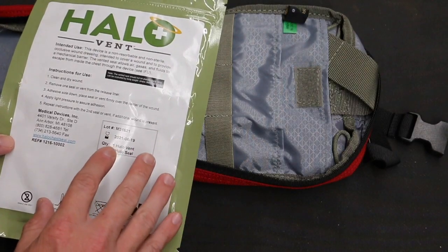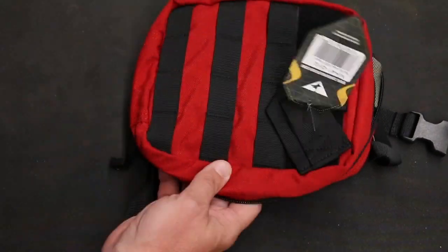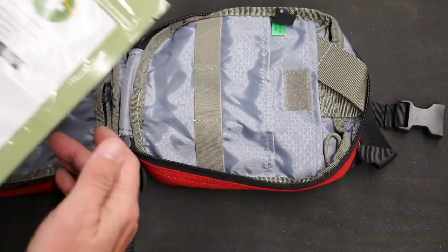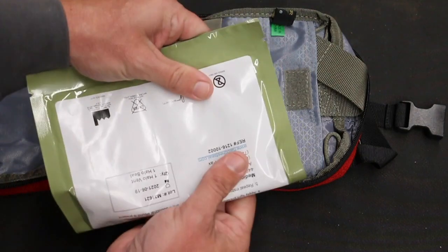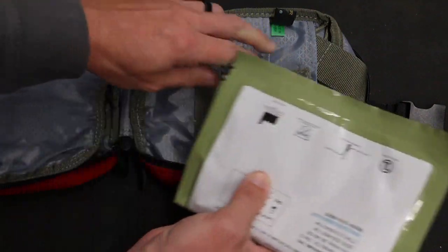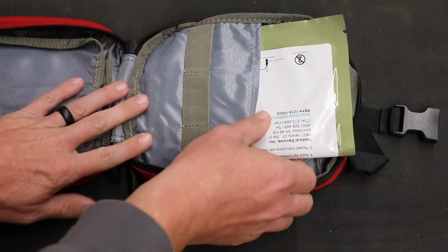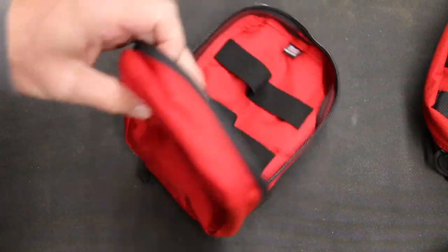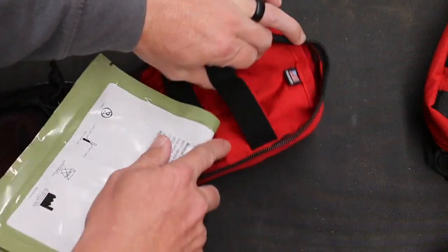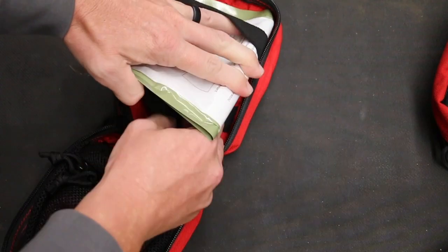I will say that one of the downfalls of the Halo chest seals is the packaging. So here, just to kind of show you an example, we have the Condor rip-away bag. This is a little bit larger bag, but these fit nicely in there. You can fold them, no problem folding these, and then they'll fit tucked down into there. But if you have a smaller bag, such like this bag here, a little more difficult. I'm not saying it can't be done, but it's a little more crammed in there.